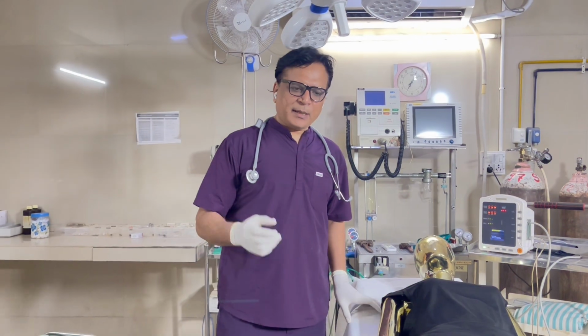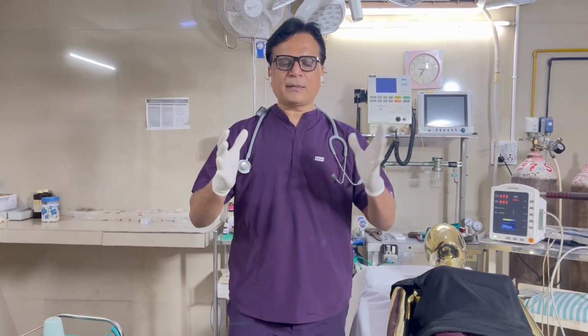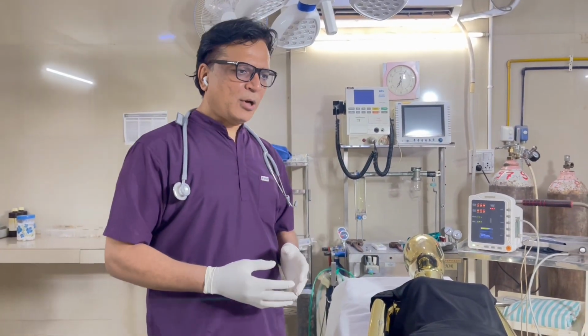So the next station I am demonstrating is insertion of the chest drain in this mannequin. Generally in this station, there is a stem where you are given, you have to put a chest drain. Once you enter inside, introduce yourself, knock the door, give your candidate number, then you are asked.